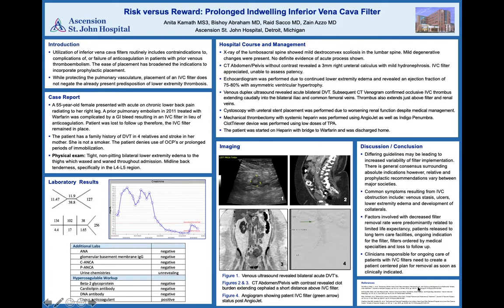On admission, the patient's creatinine was found to be 1.65, and this ended up driving the majority of her care throughout her hospital course, following a negative lumbosacral x-ray for her lower back pain. A non-contrast CT was performed to evaluate the kidneys, and a 3 mm ureteral calculus was appreciated. Patency of the IVC filter, however, was unable to be appreciated with this study.